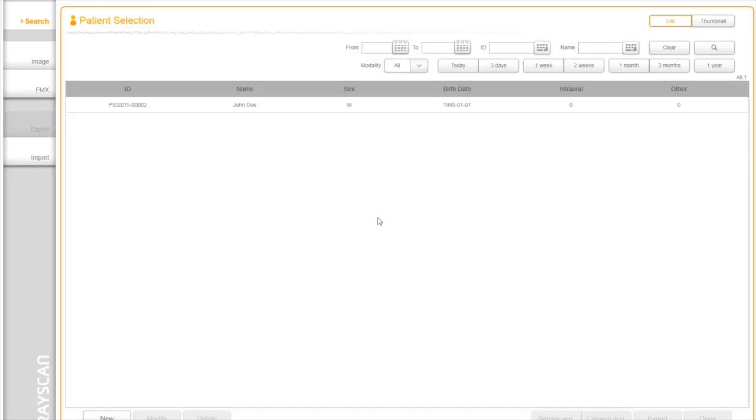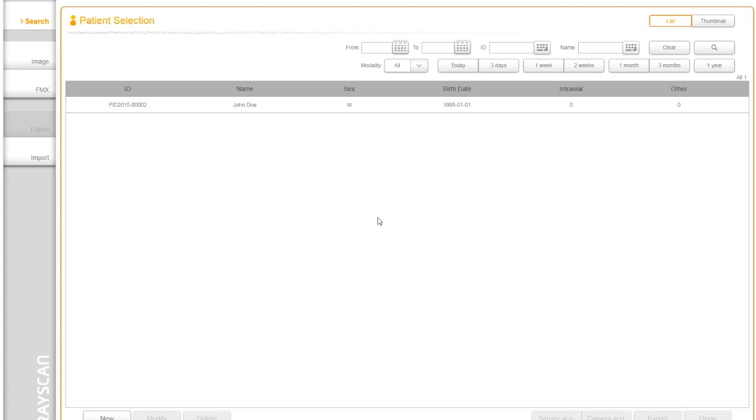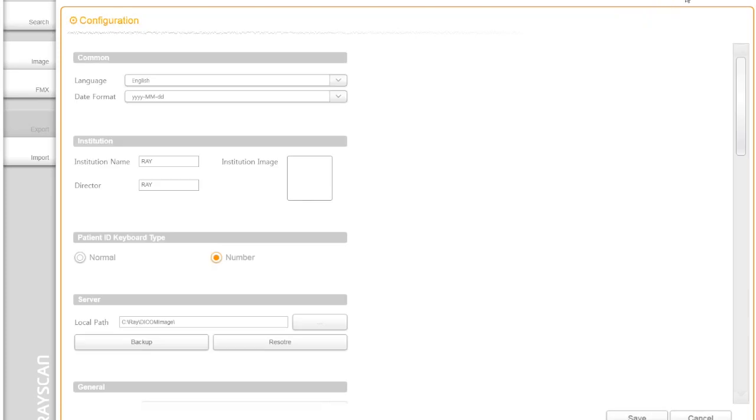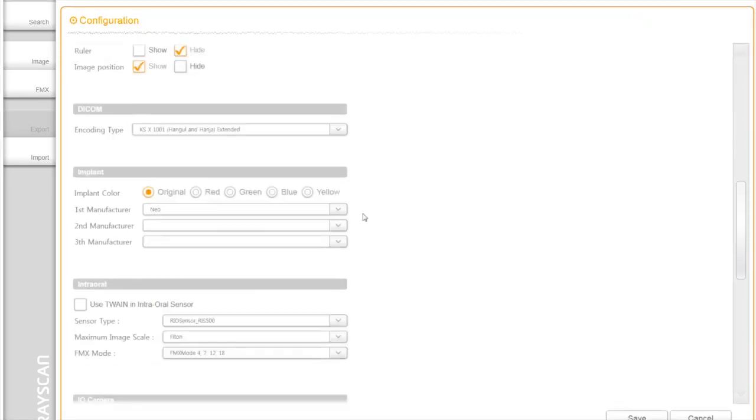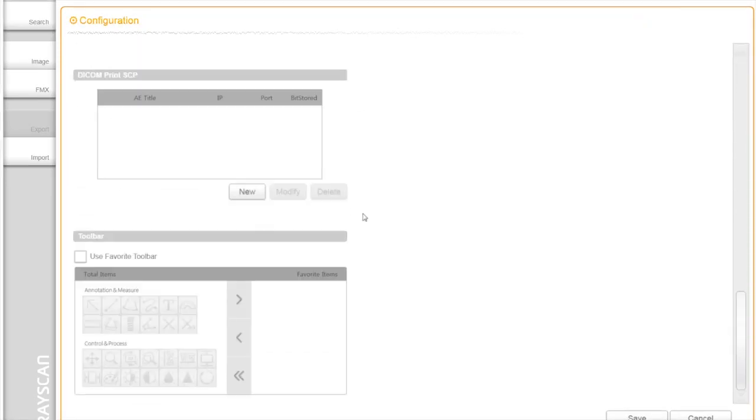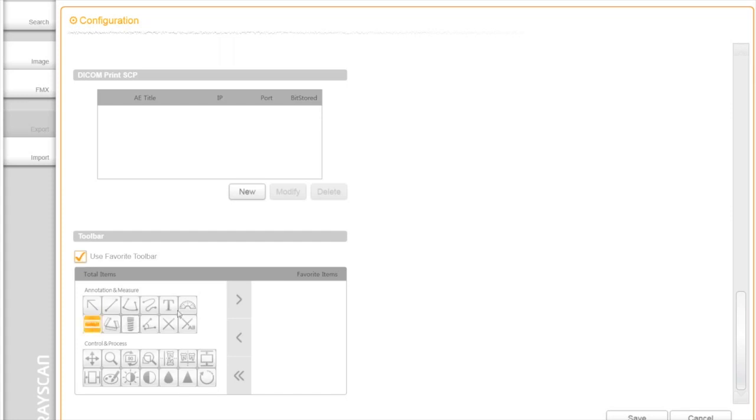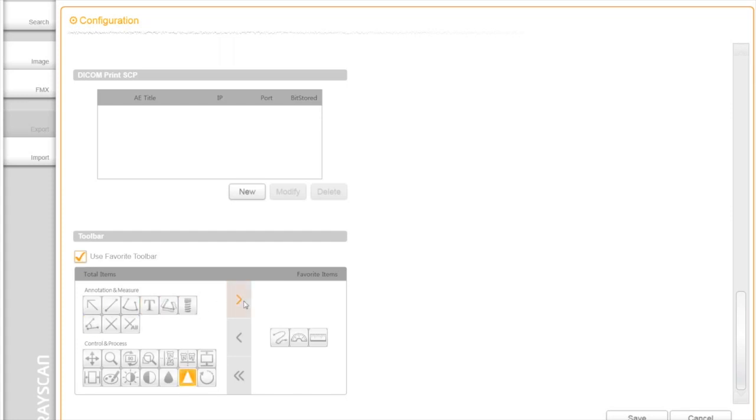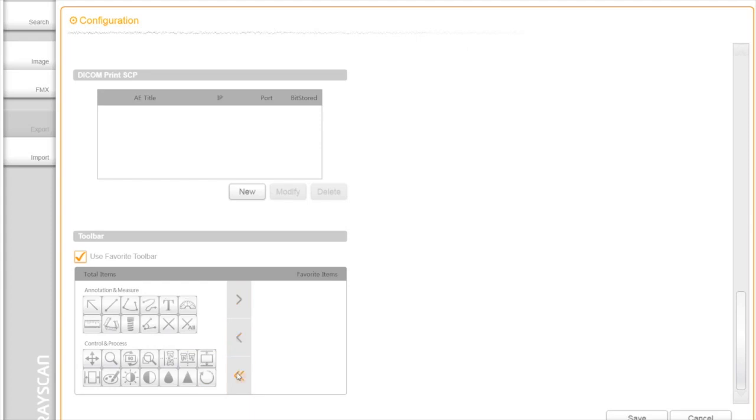The toolbar is retrofitted with the more frequently used options. Each operatory in a dental practice can have their own set of commonly used options set up on the toolbar. To switch the toolbar, go to Configuration, and click Use Favorite Toolbar option to customize. As soon as finish the setting, click on Save button at the end.